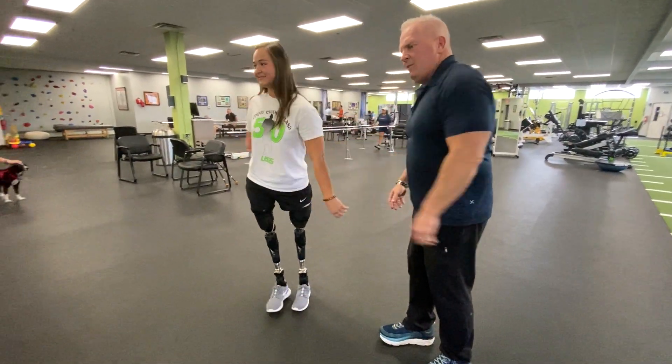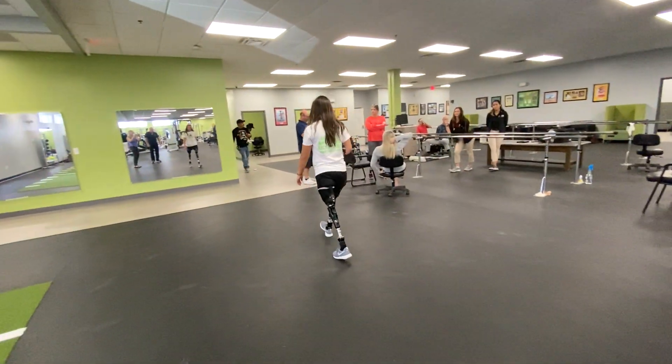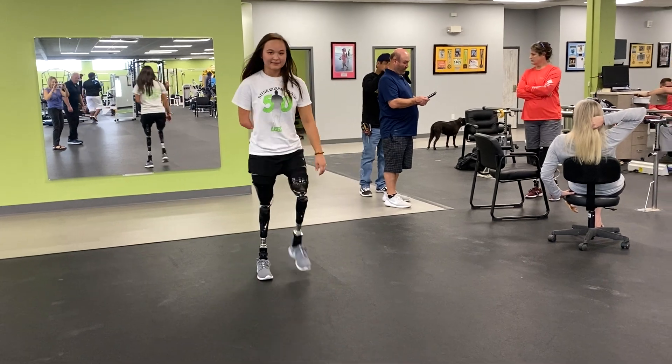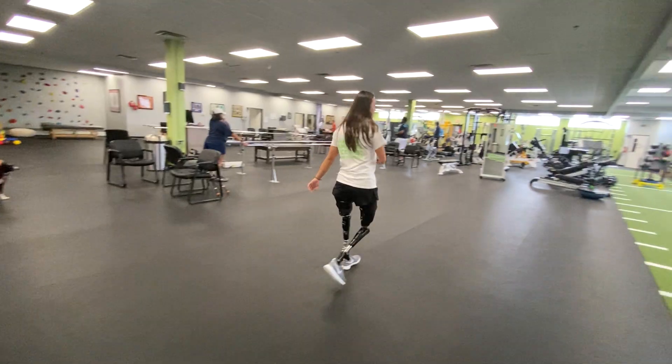Doing a great job. Can you walk for us one more time? Thank you, Ryan. Thank you, Stan.